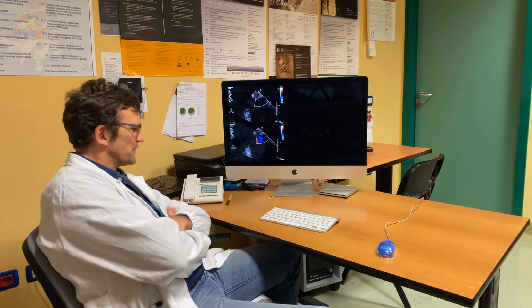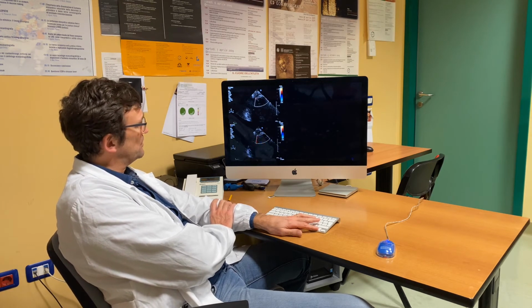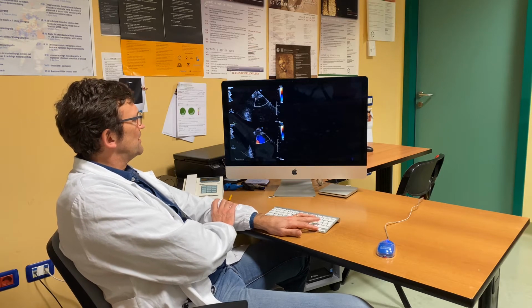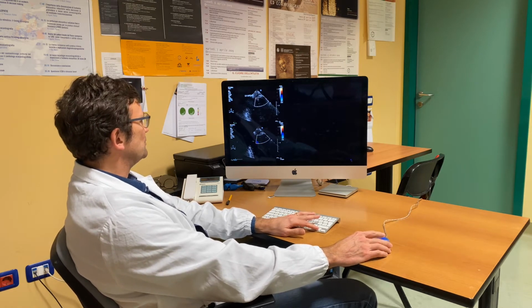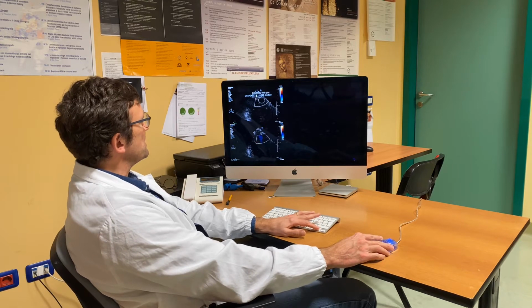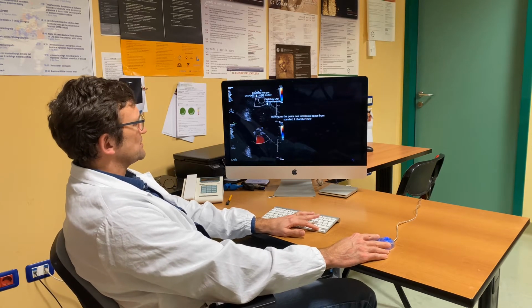This is just a couple of slides I mounted a few years ago, showing the technique to measure the coronary flow reserve. It's based on measuring the velocities at rest and then after the stressor, whatever stressor you use. The LAD is quite difficult to spot without contrast. You need to be skilled in that, and you need to know the anatomy. You have shadows from the ribs, and you have to know that you can find a distal LAD and a mid-distal LAD here, with the rib in between. So it's not very easy.